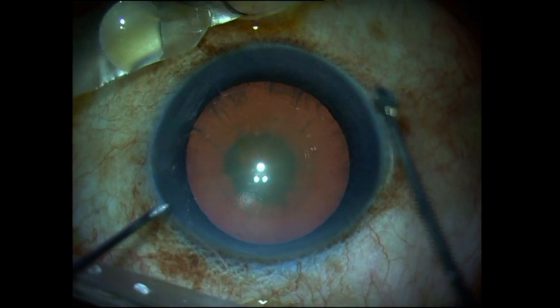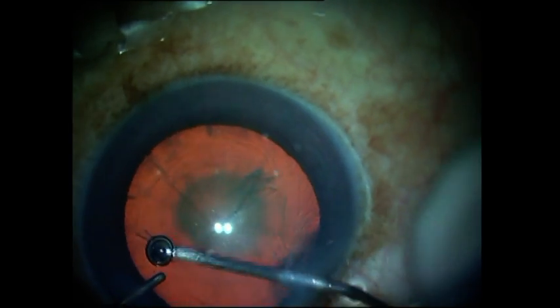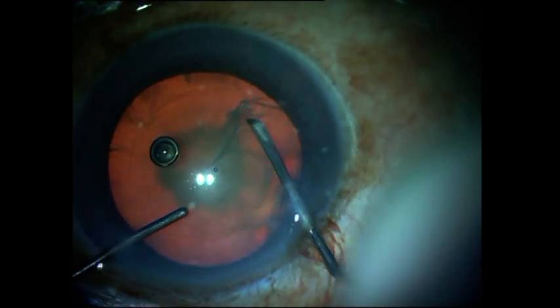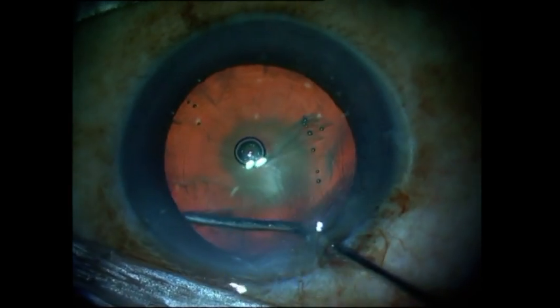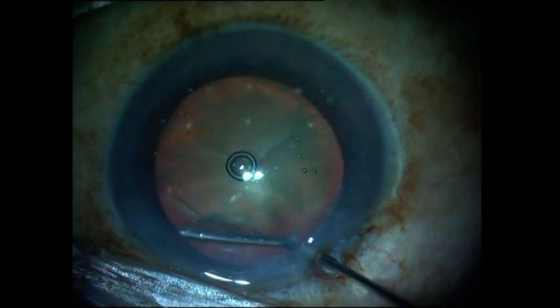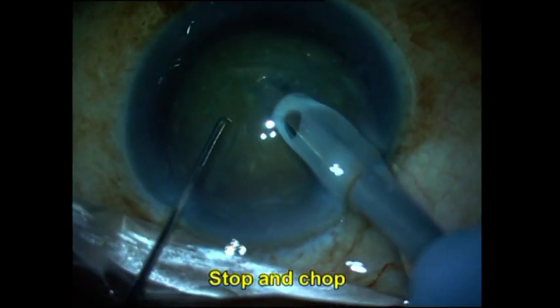Here's a patient with posterior polar cataract and nucleus sclerosis. It's important to identify this pre-operatively because the nucleus sclerosis may sometimes mask the posterior polar component — it is generally seen intraoperatively with a good red reflex from the operating microscope. I've done a rhexis and perform hydro delineation, going into the substance of the nucleus. It is important not to be superficial while injecting the fluid to avoid an accidental hydro dissection and posterior capsular rupture.